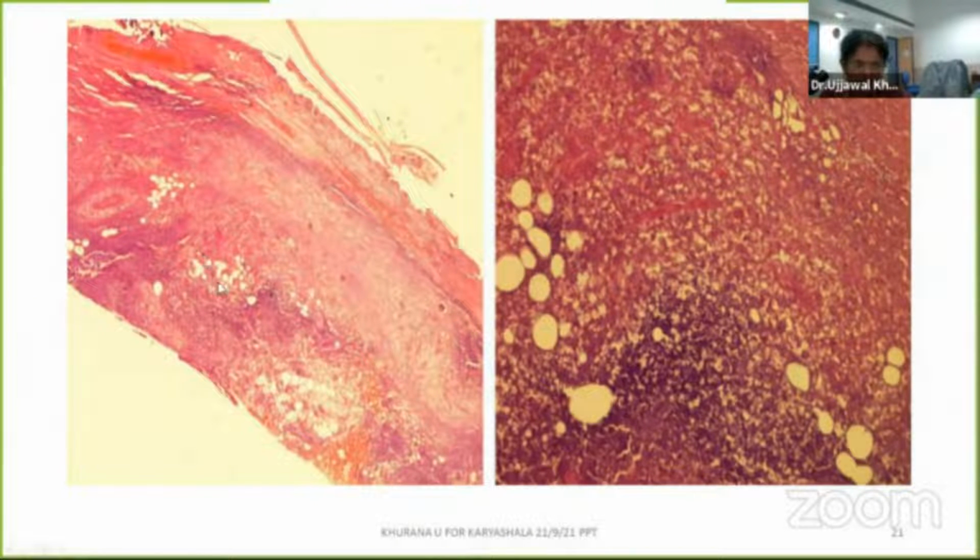There are necrosis and infarction, and GMS stains for the patient. The same patient then developed symptoms of meningism, and on higher power we could see the soap bubbly preparations showing similar structures, small yeasts which were surrounded by a halo.